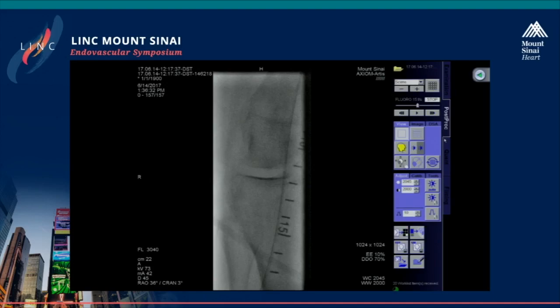Okay. So now we have a similar, like a Safari type technique. The issue is, I'm just going to pull out this catheter now. So our catheter is out. Now we just need to get a 014 balloon, or we can load the laser. You've got the wire all the way down? I don't like pulling the wire without balloon support.